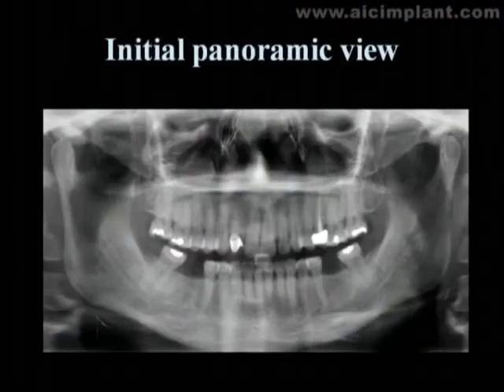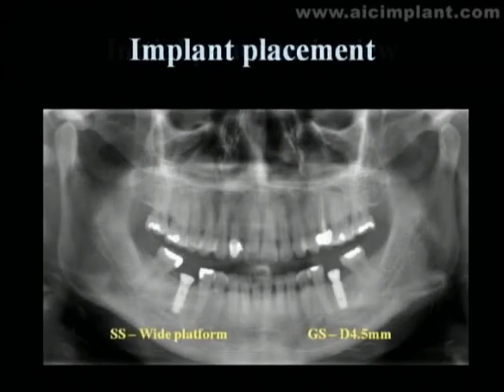Hello everyone, I am Dr. Kim Se-ung, and I shall proceed with the prosthetic procedures following the implant surgery done by Dr. Im Se-ung. This is the condition of the patient during the initial diagnosis. Implants are installed on both first molars in the mandible.